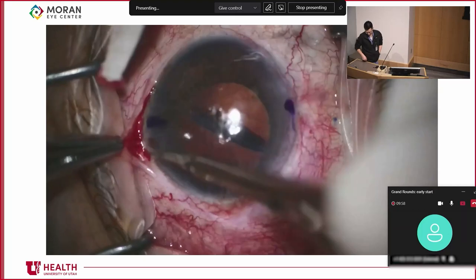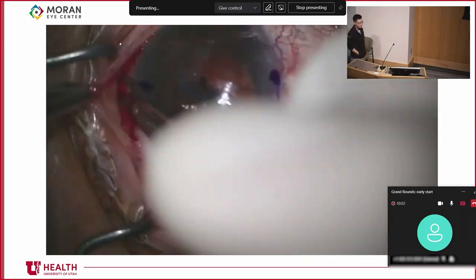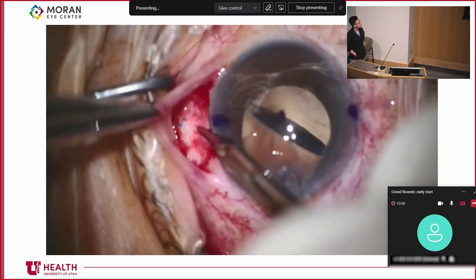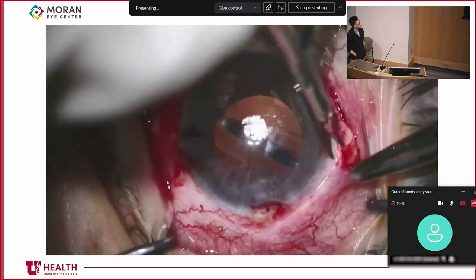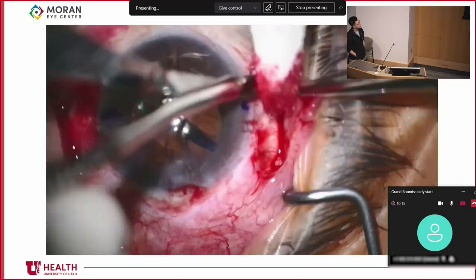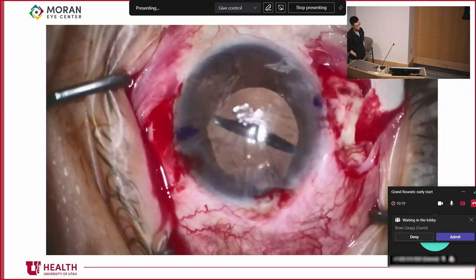All right, let's start exploring around. We've got to find those haptics. Those things must be out of place, right? Let's dig around here. We're doing a little peritomy, looking around here. Oh, there's the haptic. It looks fine. It has the bulb and it's implanted in the sclerotomy. What about the other one? Digging around. Oh, that one's fine too. The bulb's right there. So there's nothing wrong with those haptics in those sclerotomies.